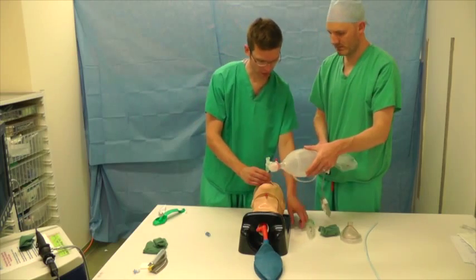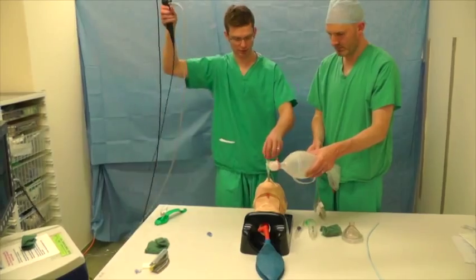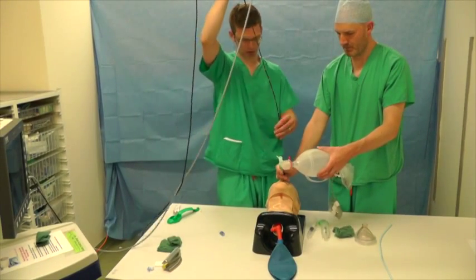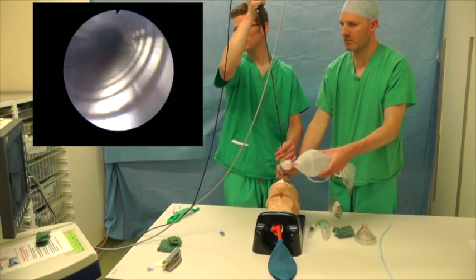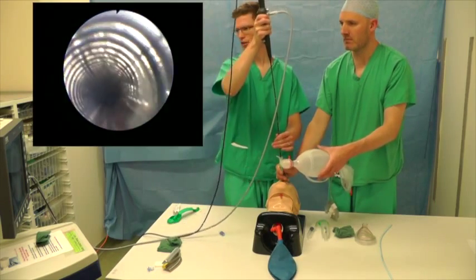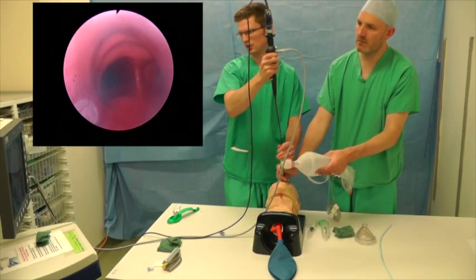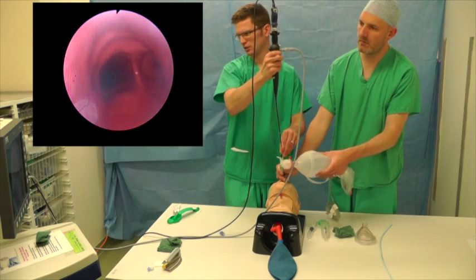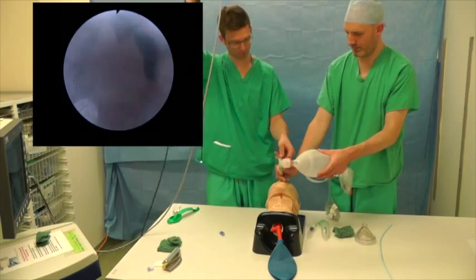Okay, let's have a quick check, make sure where we are. Let's grab the scope for it. That's brilliant. So about two centimetres above the carina — that's fine. I think we can tape that in there.